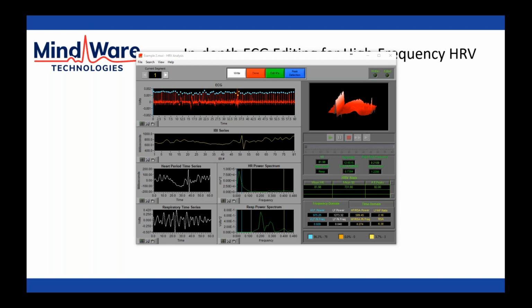The MAD-MED takes into account beat-to-beat timing throughout an entire segment, not just in that one location. So it's possible that by correcting other beat-to-beat timing in other parts of the segment, the algorithm sort of corrects itself and starts to see that beat as being acceptable again. So those are the two approaches that I would suggest you take if you run into that situation.